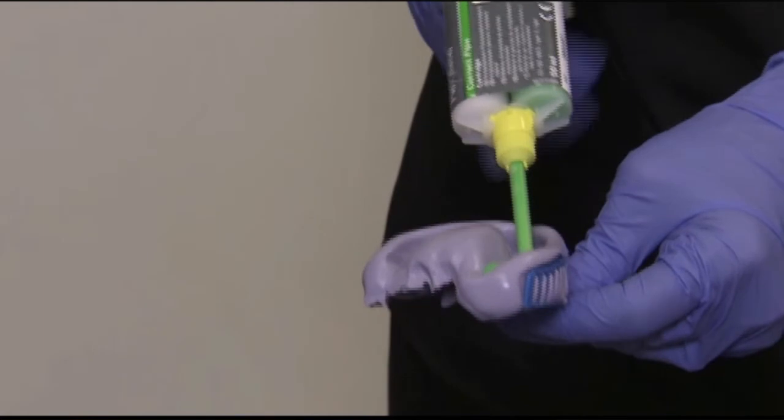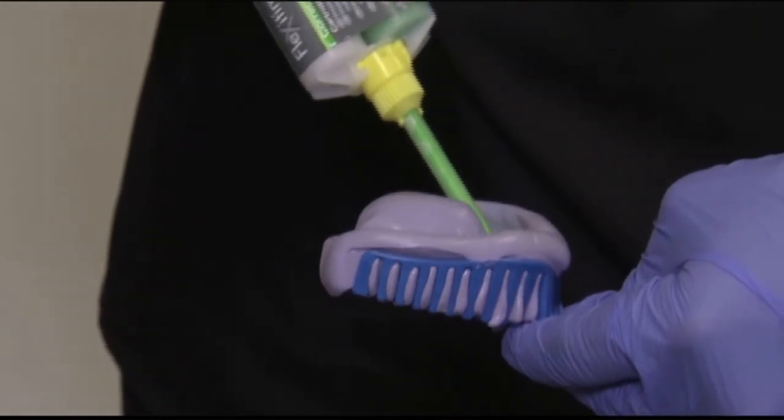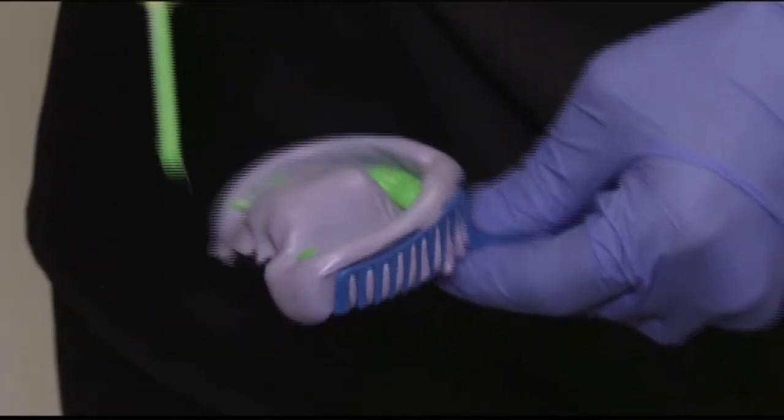body wash, and this is Correct Flow wash. I'm going to start with the last molar and go all the way around. My impression is not coming from the putty. The putty is just a cushion. My impression is coming from the impression material. And notice I've got about an inch wide of material.